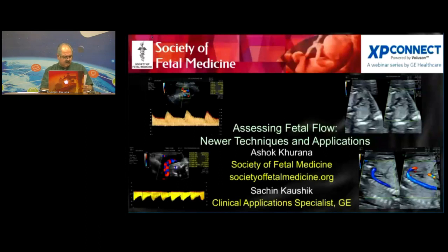And meanwhile, while it is opening, it says, sir, how to measure the aortic isthmus? Well, you visualize the aortic isthmus. And the way I do it now is not in a longitudinal section. For measuring, I just go to my three vessel view and I see the junction of the ductus arteriosus with the aorta, and I say, okay, that is where my isthmus is expected.